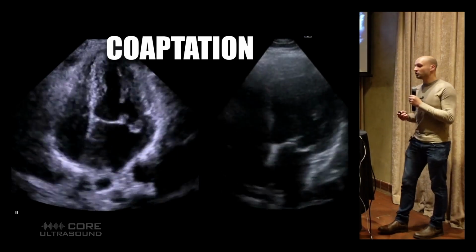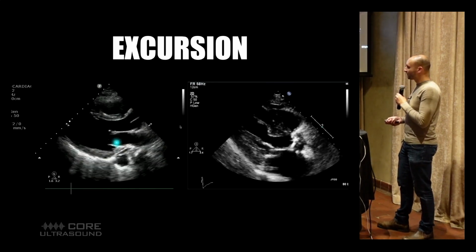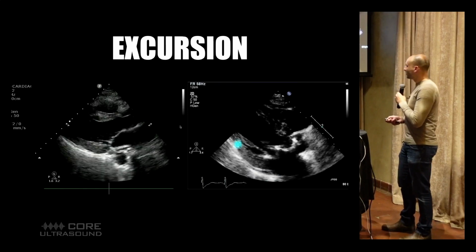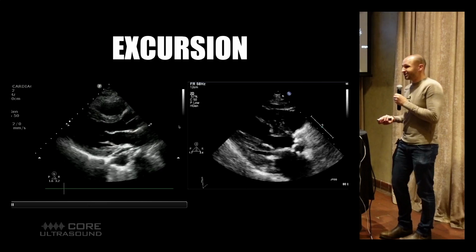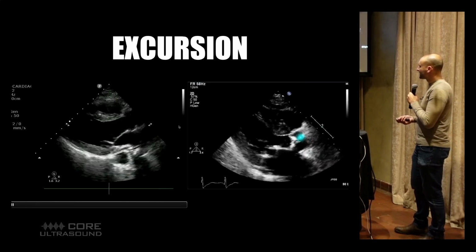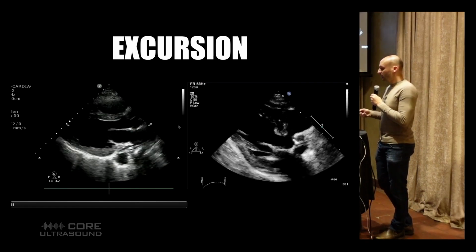The next thing I look for on the two-dimensional evaluation is the evaluation of stenosis. On the left hand, we have great excursion here. This mitral valve is opening up very nicely. The aortic valve here is opening up very nicely. And on this side, we have not those things. Now, if we look at the overall ejection fraction of the chamber right here, it's not too bad. It's a little diminished, but it's not too bad. Pretty thickened walls over here as well. But if we look at the mitral valve here, barely opening up. If we look at this aortic valve, barely opening up as well. So it's pretty easy to say, kind of binary, yeah, I think there's some stenosis or not, based off of how well those are opening up.